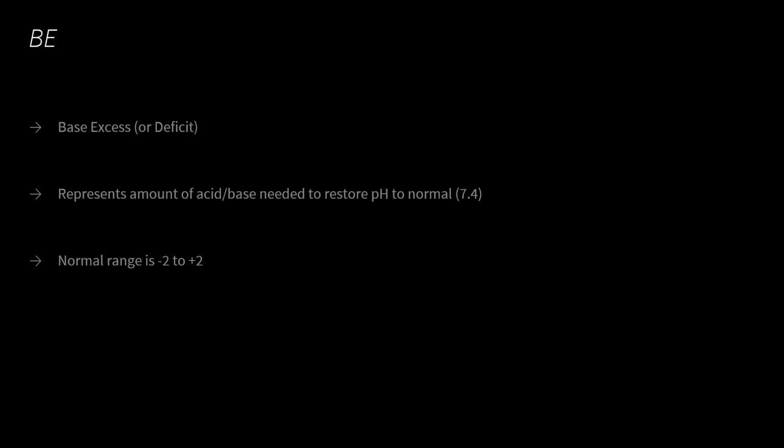And so again, it's something you can use when you're trying to calculate bicarbonate replacement and some other things when we get a little bit more into the advanced interpretation of the acid base of a patient, but in general, it's not necessary for ABG interpretation.